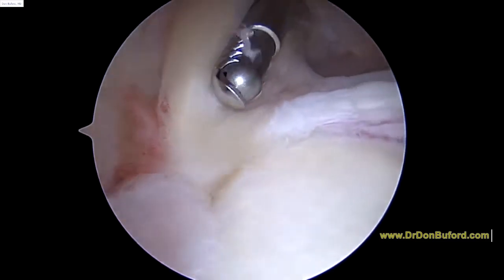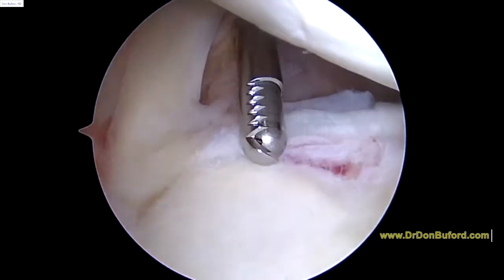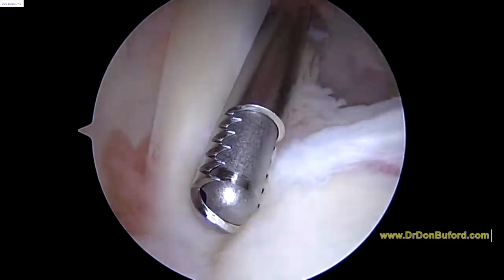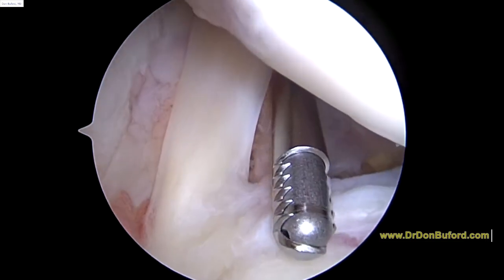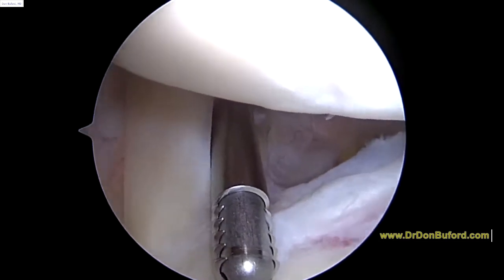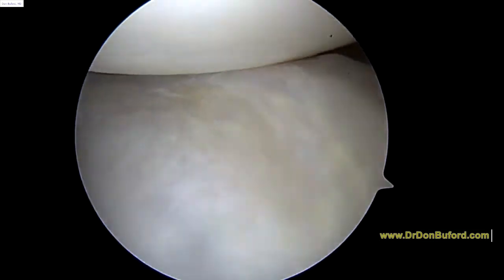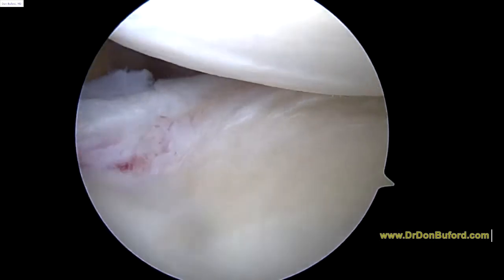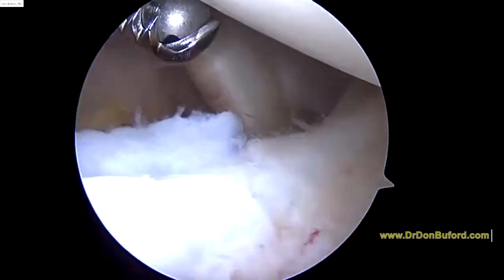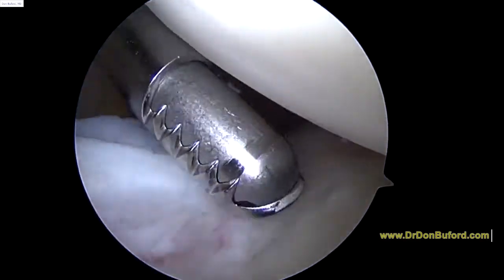We'll look at the biceps anchor. Those are normal wear and tear changes. That looks great — no signs of any significant problem there. We're going to rotate the camera and look around towards the back of the shoulder. That looks good. Some generalized arthritic changes, but nothing significant to worry about. Here's the leading edge of the subscapularis tendon, here's the anterior labrum, and those structures look good.